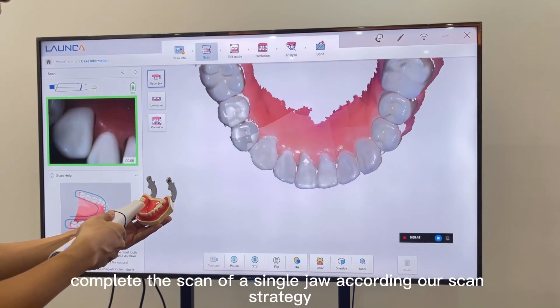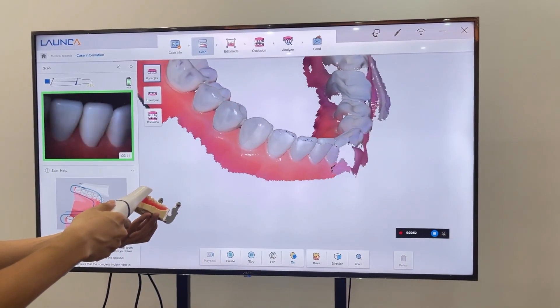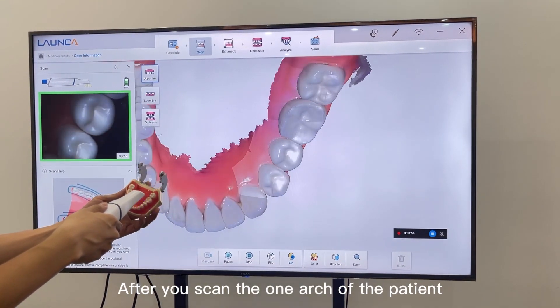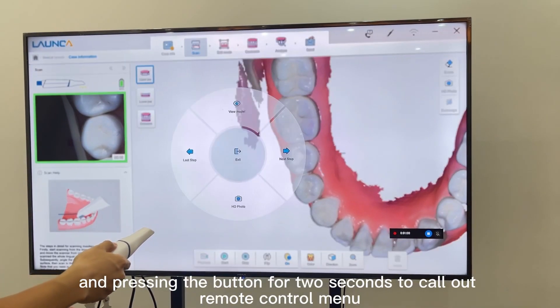First, complete the scan of a single arch according to our scan strategy. After you scan one arch of the patient, press the button to pause the scanning, and press the button for two seconds to call out the remote control menu.